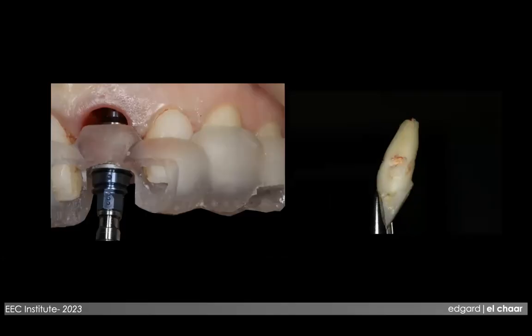You can see here we have an external resorption of that tooth. And we place the implant with the 3D printed guide from that study that we have done from the planning that we have done. And then after that, I place the implant, I put the allograft, human source. Here, I don't have to go crazy because it's a thick biotype. I do only cancellous based on my roadmap. And then you can see this is the tooth, and this is the implant with that crown.